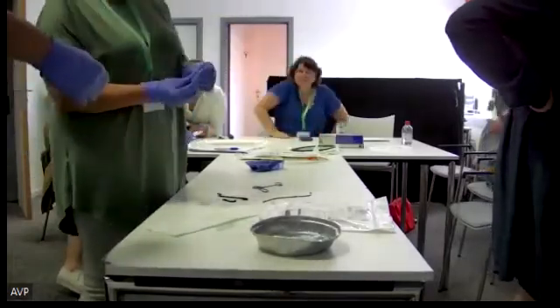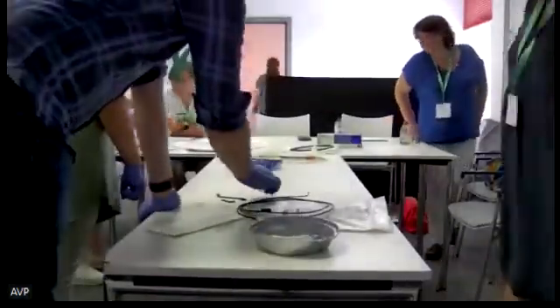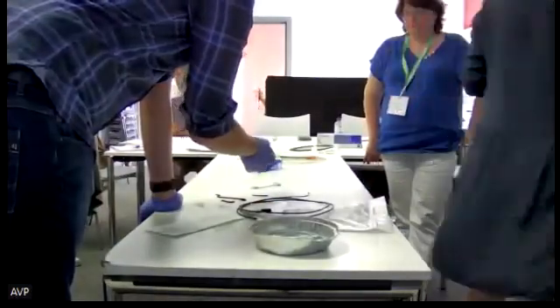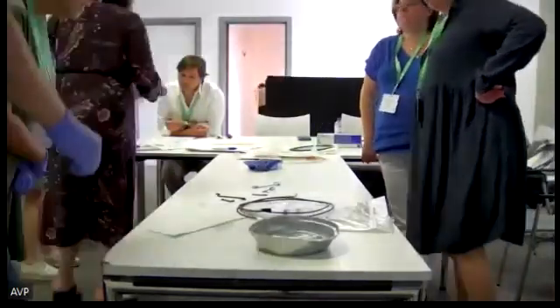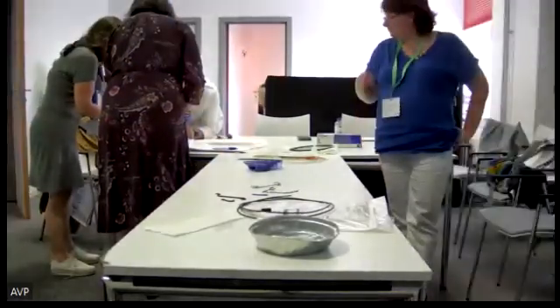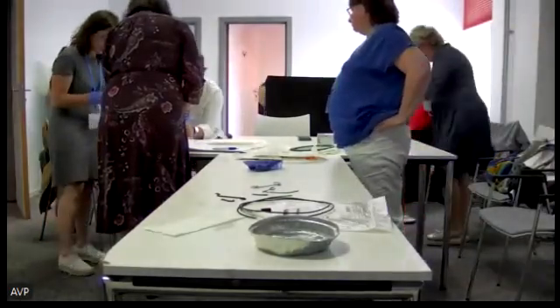So the FNA needle is just a simple design. This is the sheath, to bring out the needle.